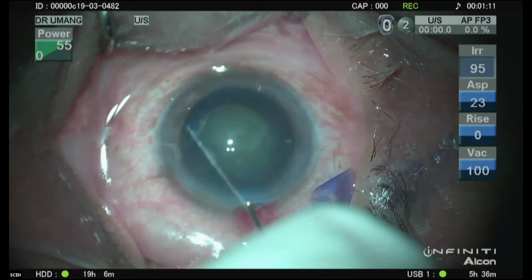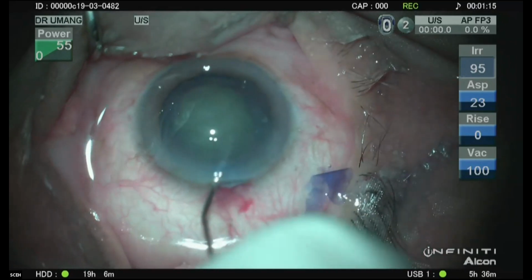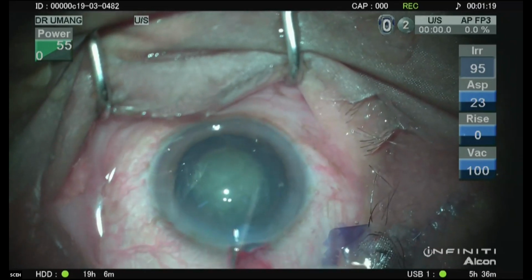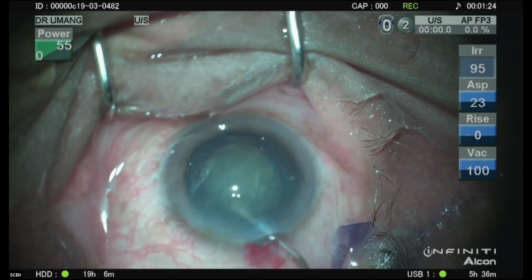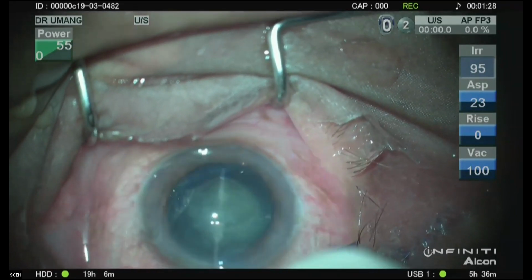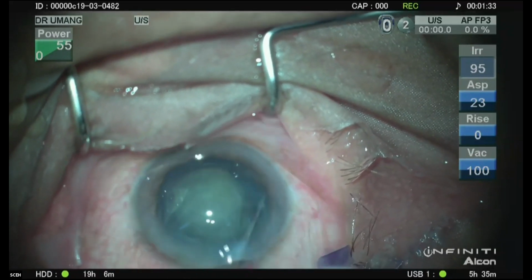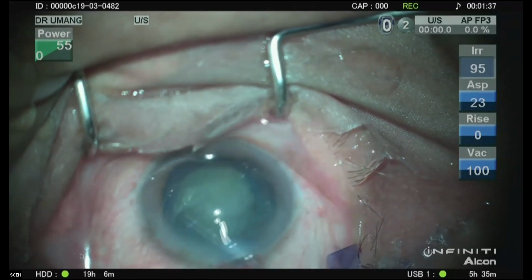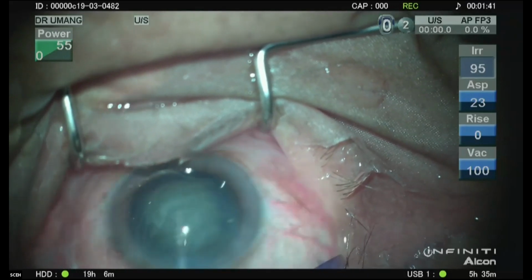I'm doing a little delineation, and I can see some delineation happen. You can see the edge over here. So the idea with the hydrodissection is that you should be able to move the nucleus so that you can attack it from different angles.